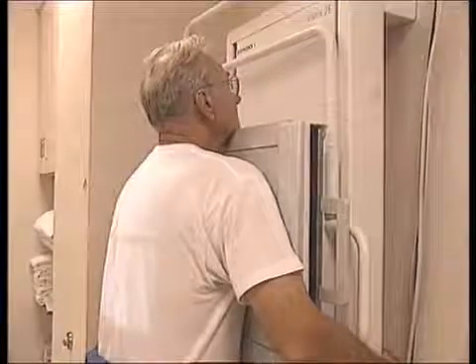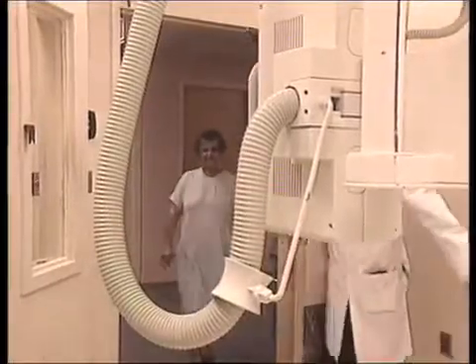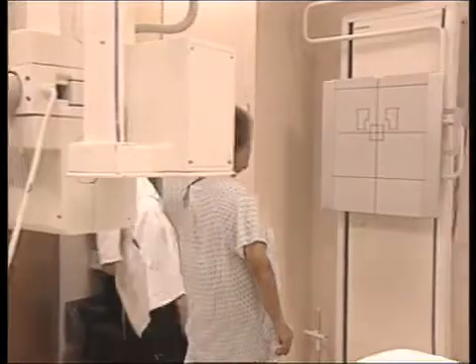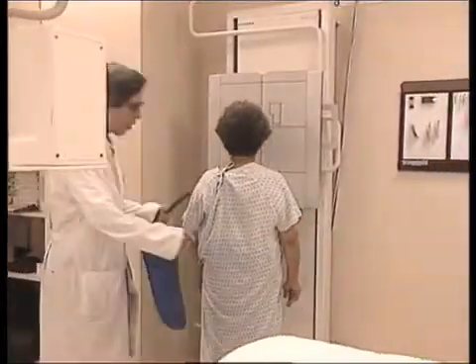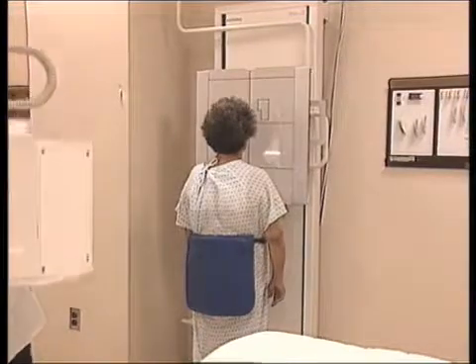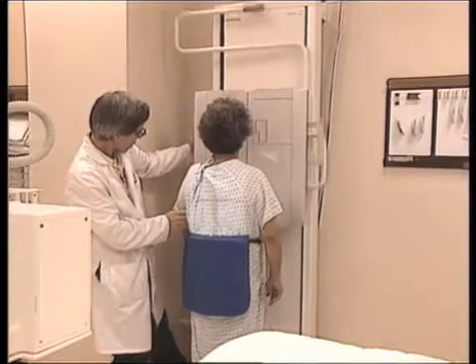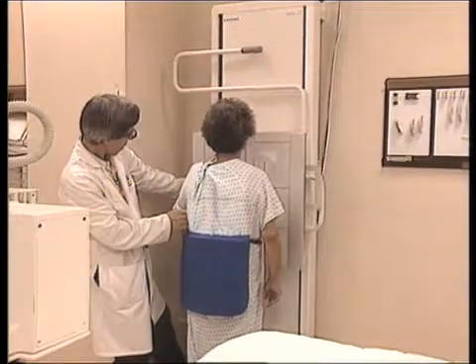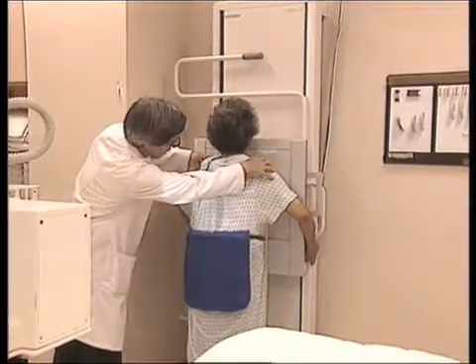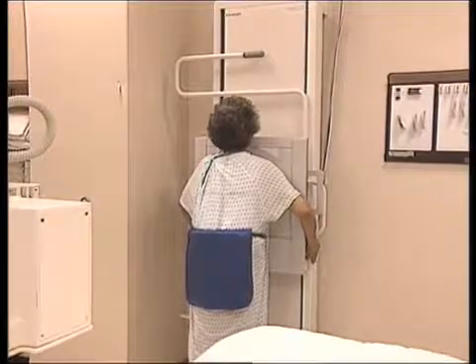Mr. Trachy, taking a deep breath — hold your breath, sir. Step right over here. Facing this plate — I'm going to give you an apron for some protection. Wrap your arms around it, kind of hug it, touch lightly against the plate. Ms. Breckenridge, taking a deep breath — hold your breath.